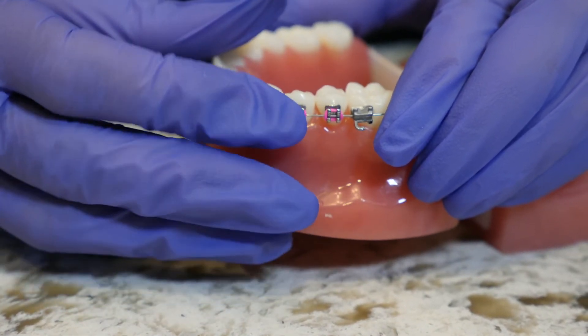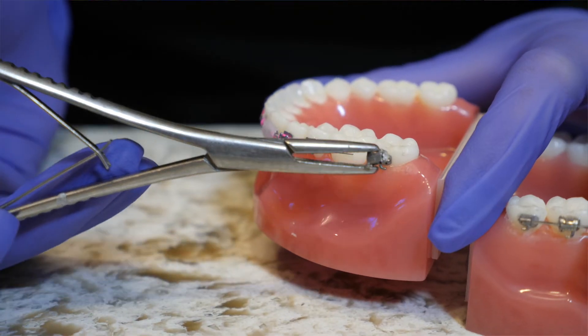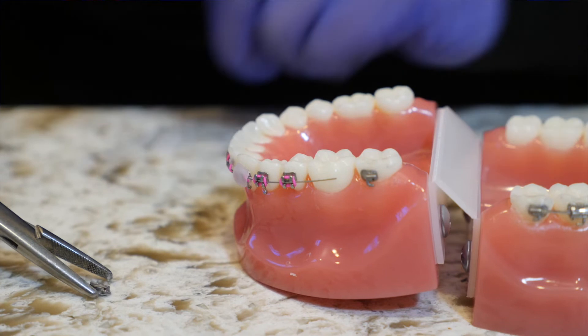If it's one of the back brackets, you can remove that bracket with some tweezers, take it off, and then clip the wire where the next bracket is. To find out how to clip a wire, you can watch our other video. After you are done with that step, you can give us a call to get you scheduled to repair.